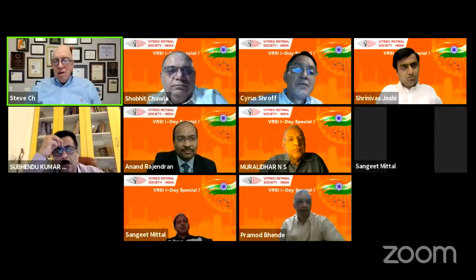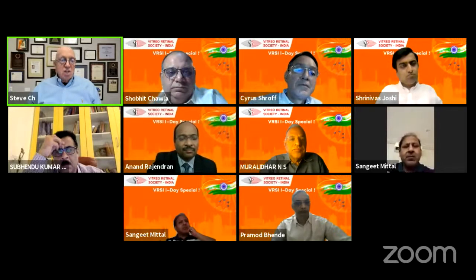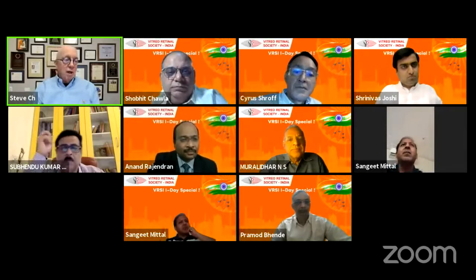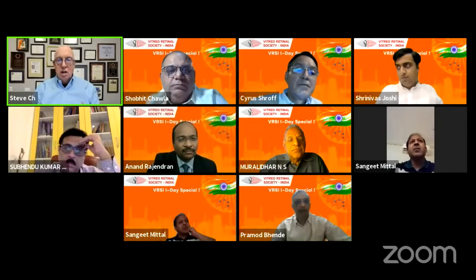Now, there are a very, very few exceptions. I've had patients with an inferior detachment say, I've got to fly in an airplane tomorrow. I can't come back for 2 months. Okay, I put a buckle in. I had a lady that's pregnant with 3 months before delivery in bilateral inferotemporal detachments. I did a segmental buckle in each eye, 15 minutes per eye without any sedation. So there are some unique circumstances, but instead of the young phakic patient, myope, the standard of care being a buckle, we need to move to the standard of care being a vitrectomy.